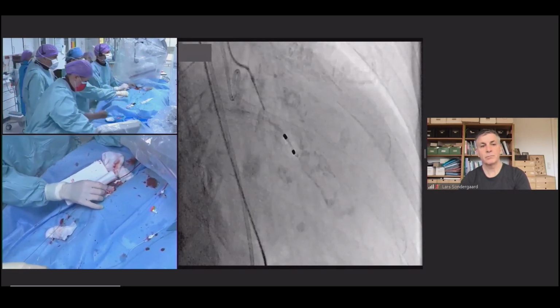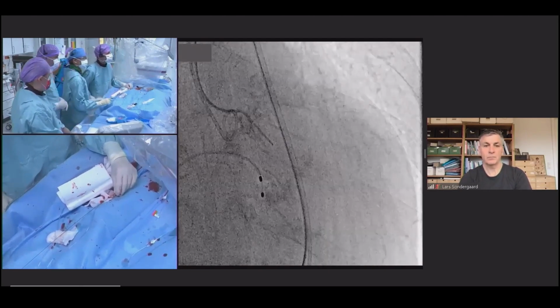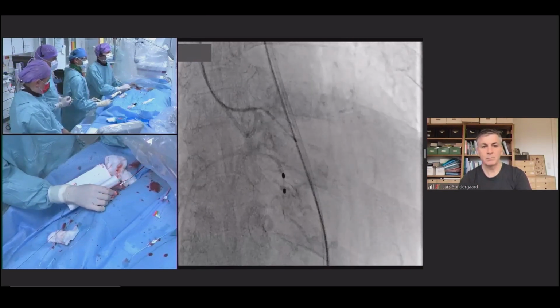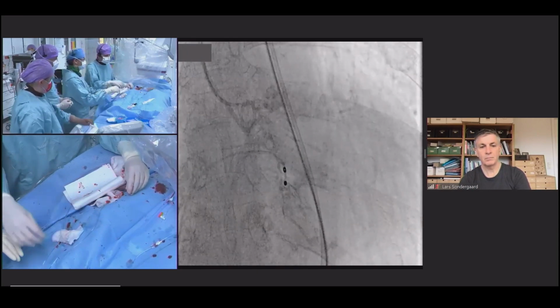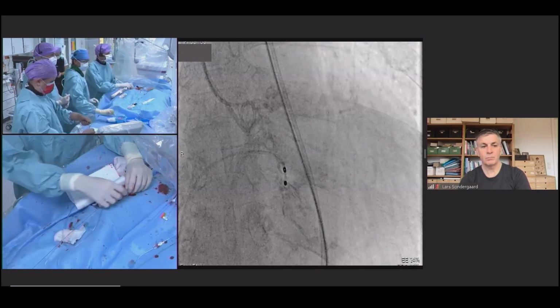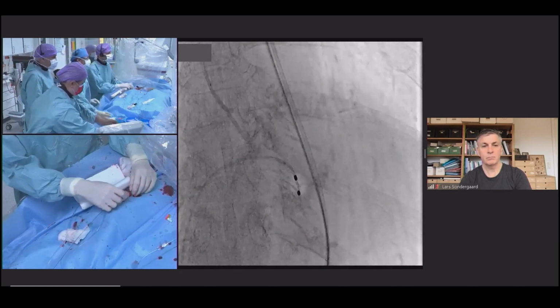So Ole is just trying to advance. You see, it's very calcified. It's hard to get deeper down with your wire, to bring the catheter further in here. So you can go deeper. But then we're going to put an exchange wire in. We're going to put a pigtail catheter in. And the reason we use the pigtail catheter is, first of all, to have assessment of the degree of paravalvular leak afterwards. The patient is treated under local anesthesia, so we cannot do a transesophageal echo. So we're going to rely on aortic root injection as well as hemodynamic assessment.